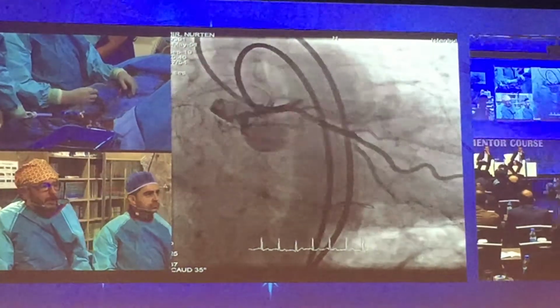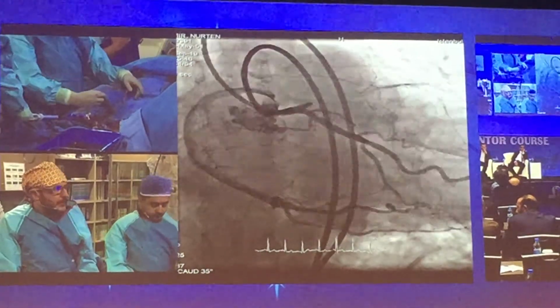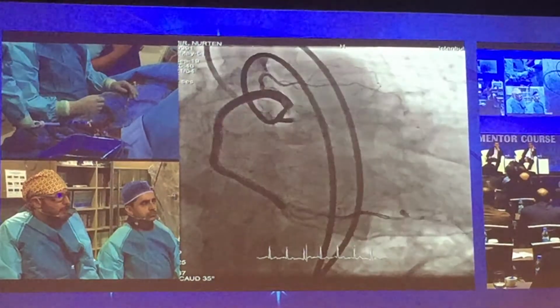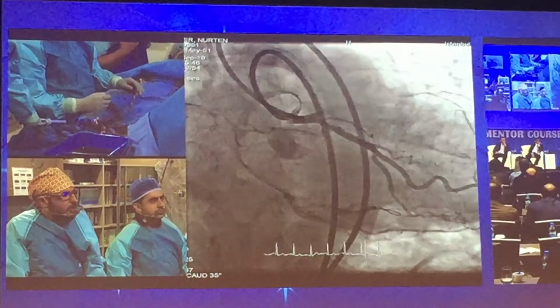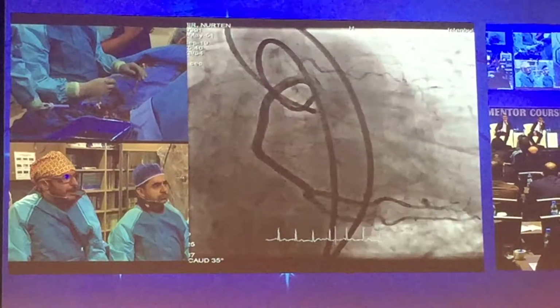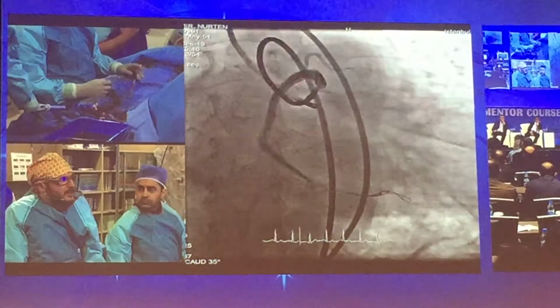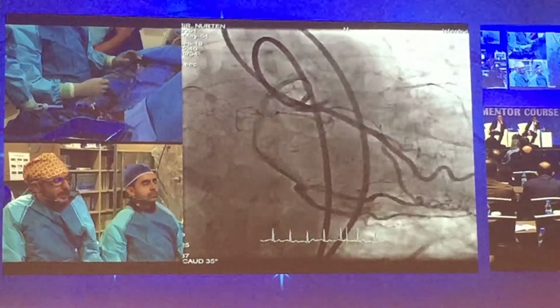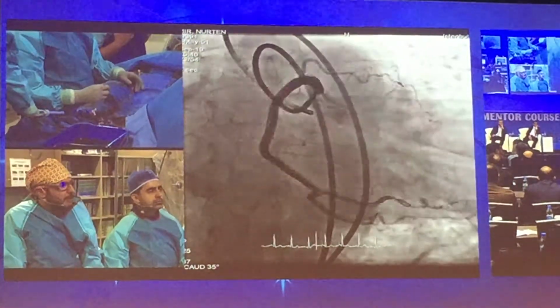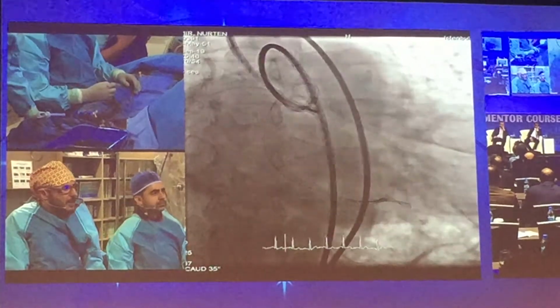So we had a bilateral injection from 2 different views, and it was very difficult to adjust the angiographic views because, as you see, we have the femoral catheters coming from below, so it hindered us a lot to have a good view. But we somehow see the tapered lesion. At first we thought that it was a blunt occlusion, but then with different views, with bilateral injection, we see this tapered lesion here. This is the first attempt.